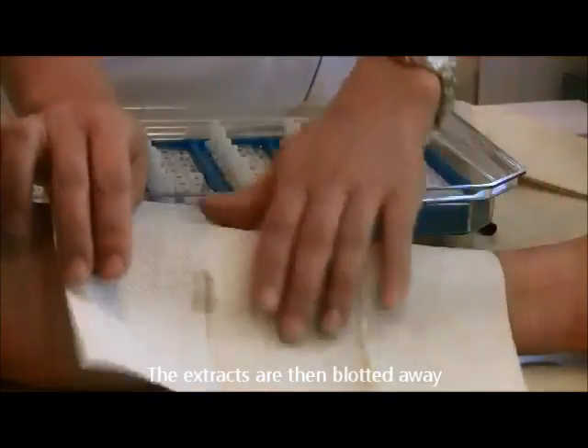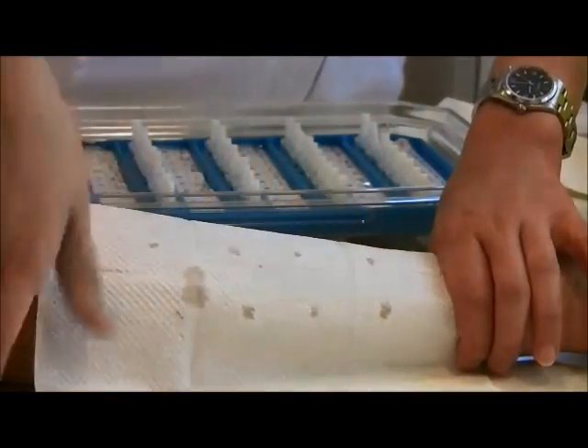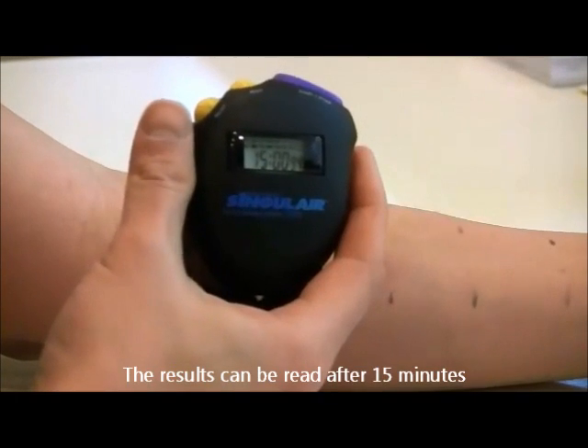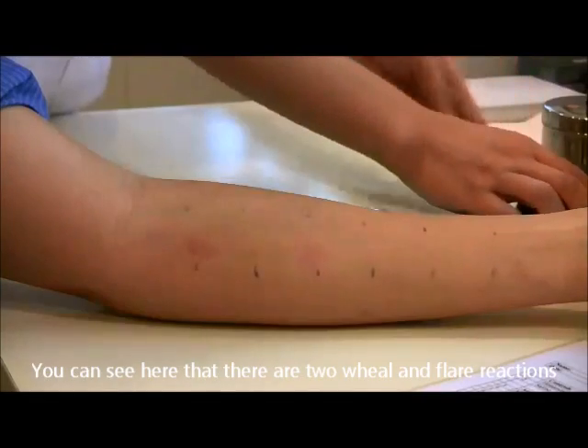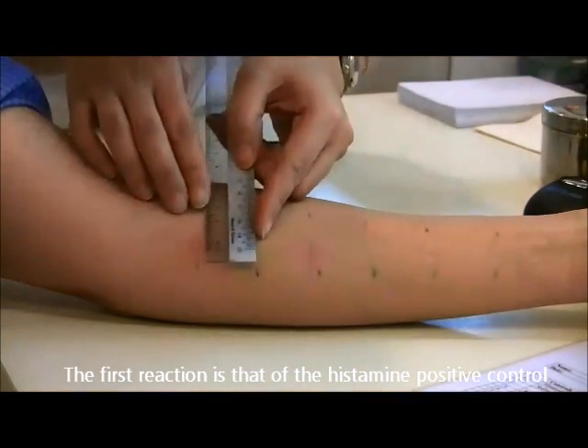The extracts are then blotted away. The results can be read after 15 minutes. You can see here that there are two wheal and flare reactions. The first reaction is that of the histamine positive control.